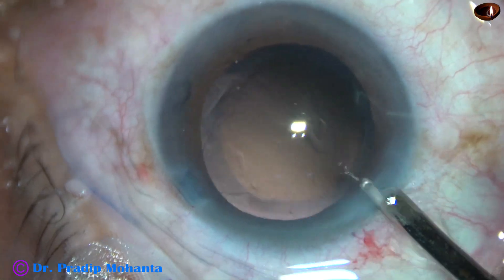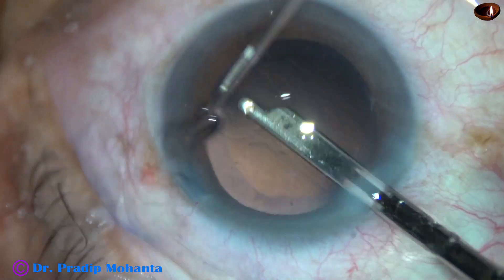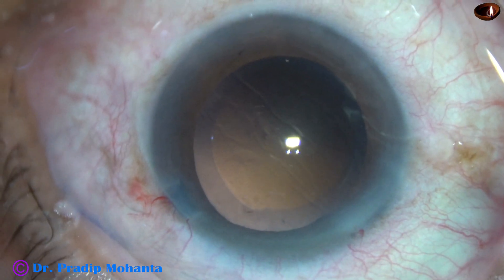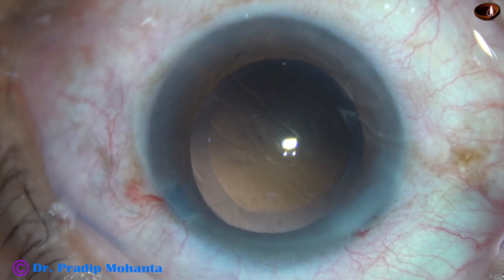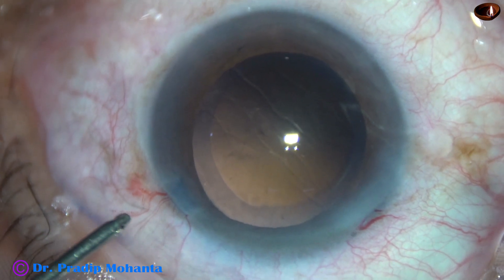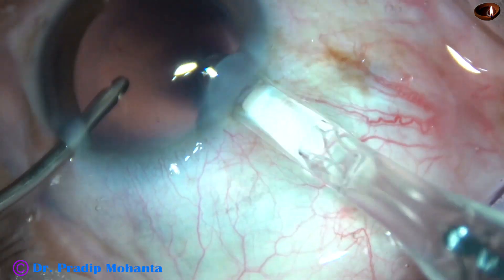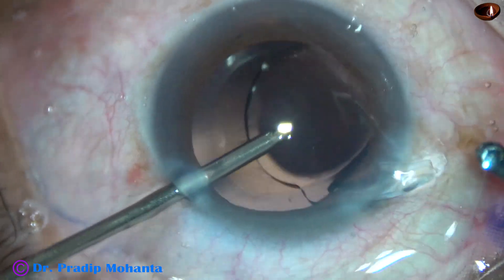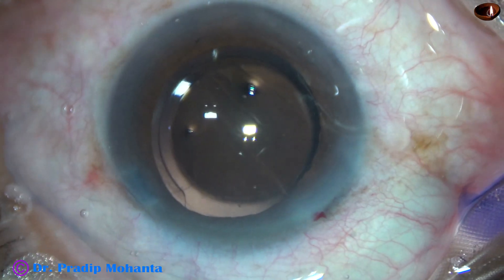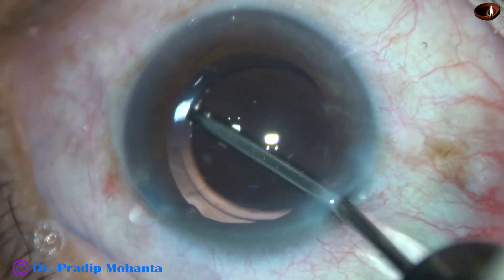This is a totally unedited recording and you are not missing anything. And now is the time to implant an intraocular lens. The anterior chamber is maintained by irrigation and the intraocular lens is implanted in the capsular bag. Whatever visco was there in the lumen of the cartridge is irrigated out.